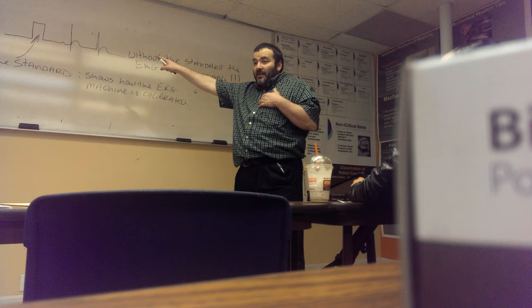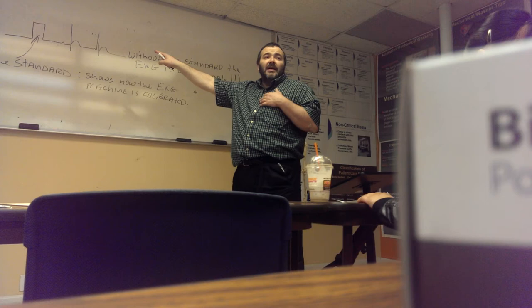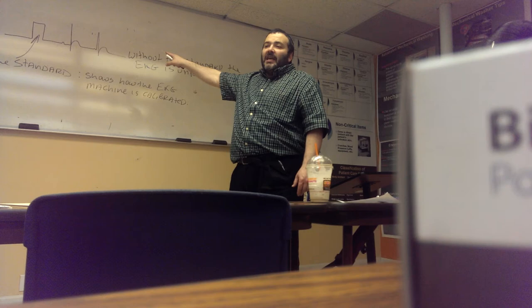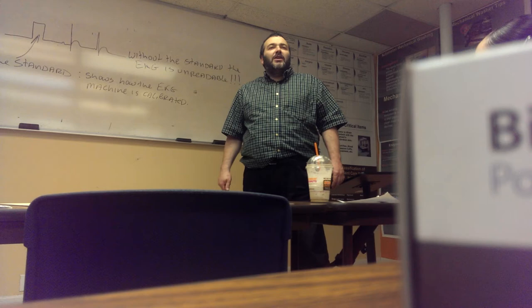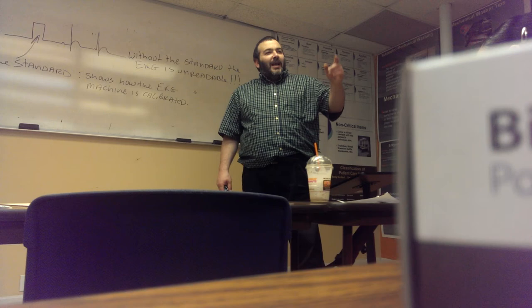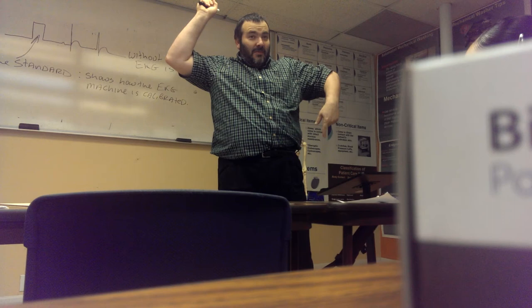Okay, so that box right there, sometimes it's thinner, sometimes it's higher, it doesn't matter. But something that looks like this at the beginning of the EKG tracing, that thing is called the standard. Without that standard, the doctor cannot read the EKG, a diagnosis cannot be rendered, and you did your job poorly, and you have to do it again. So remember, if lead one is not pointing up and AVR is not pointing down, you did the wrong thing. Switch the sides. And if you got no standard, go back and do the EKG again.